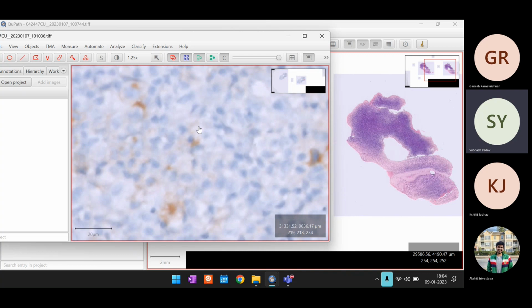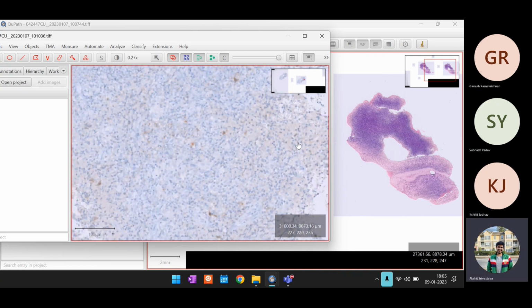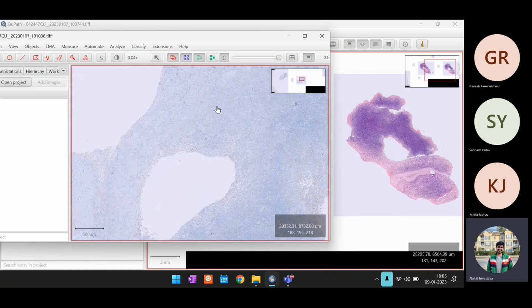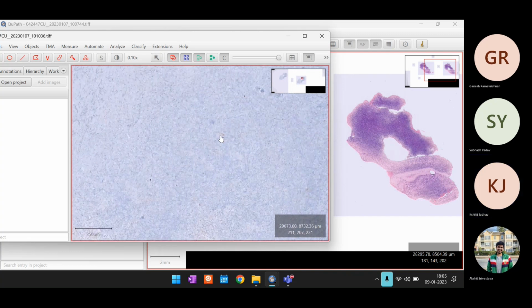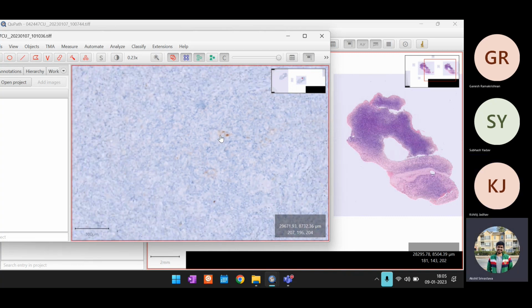Right now, we're going to overlap these two, right? That would be the second objective, afterwards. First, you have to find the Reed-Sternberg cells in this particular image. Would we still be using the data programming approach to identify the RS cells? I think so. Yes.